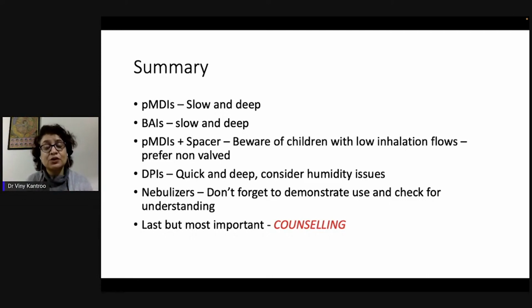The reason is, for the powder to come out of that inhaler device, you actually need quicker power to release those particles and disintegrate them from the rest of the particles. So the action should be quicker and deeper in case of dry powder inhalers, and it should be slower and deeper in case of pressurized MDIs or the breath actuated inhalers.